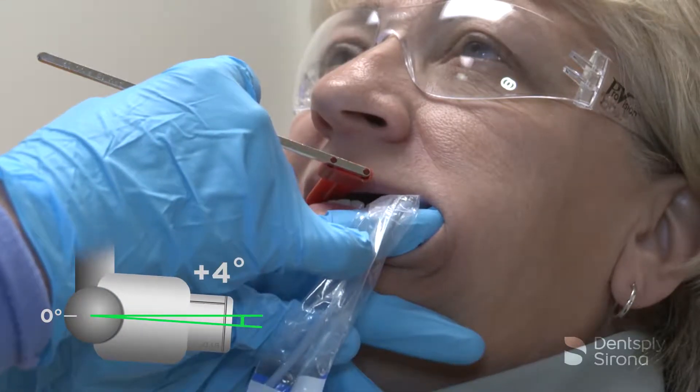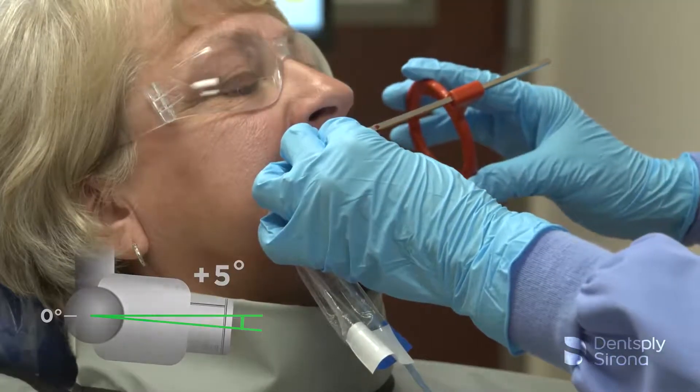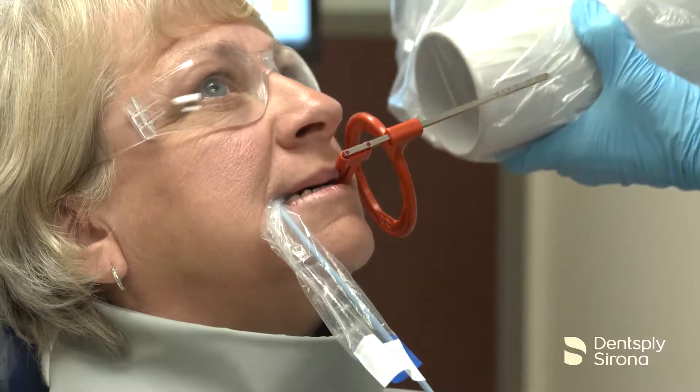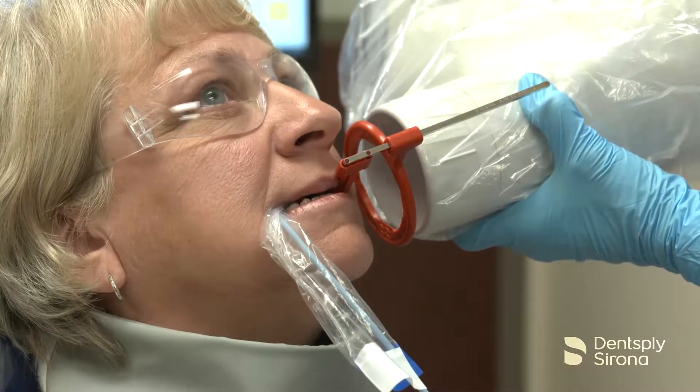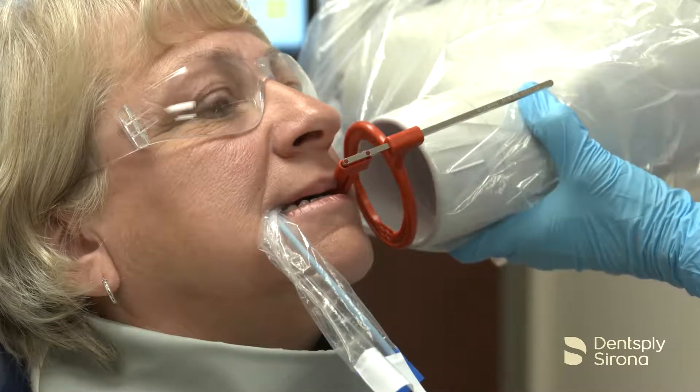The vertical angulation is typically set at positive 5 degrees. Once the bite block is in place, slide the aiming ring down the arm close to the patient's face. Align the tube head of the x-ray unit in close approximation to the aiming ring and center it. The x-ray image is now ready to be captured.